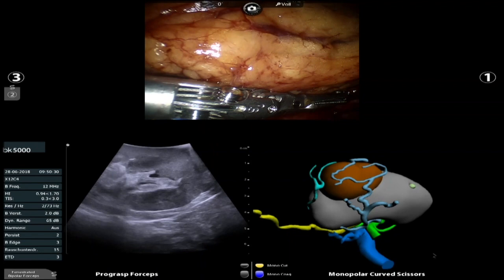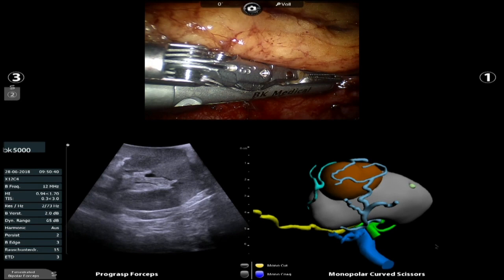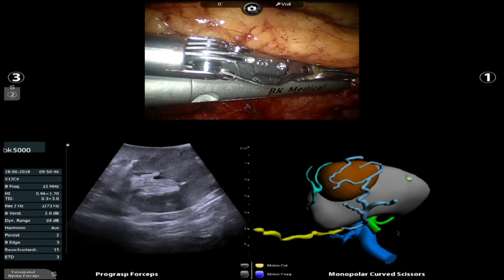See right there, the tumor looks like it projects. Look right there. Do you see the ultrasound? It looks like it projects. Yeah, there's a little projection into the sinus fat of the tumor. This is what I saw in the X-ray. There it is, right there. You see that? Do you see the ultrasound right there?